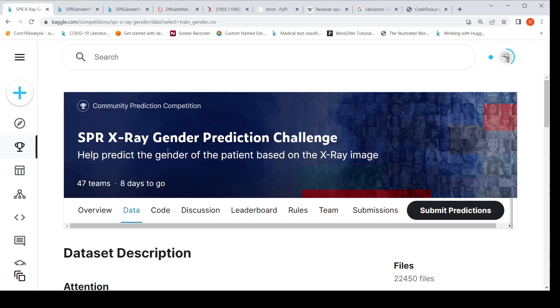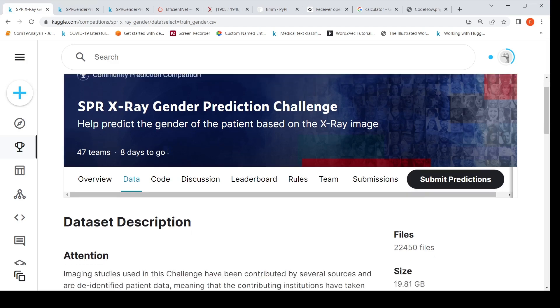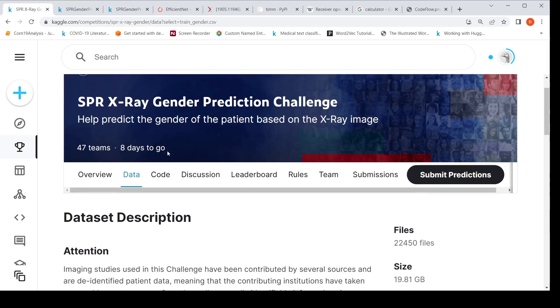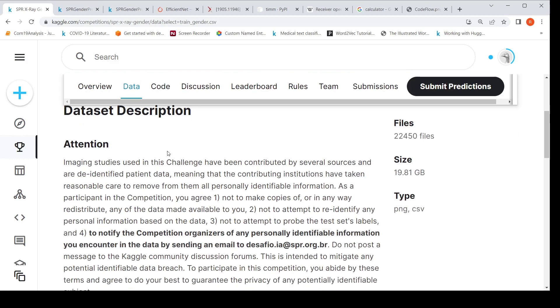So first, let's look at how the data is present in this dataset. In total, we have 22K files here. The size is close to 19.81 GB. You have both PNG images and CSV files.